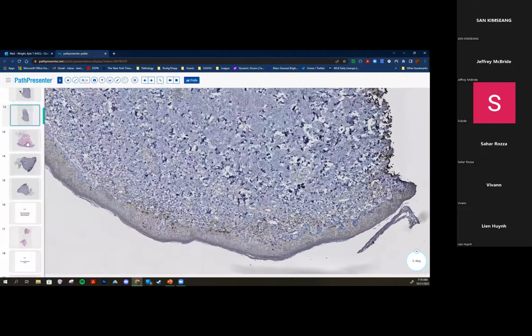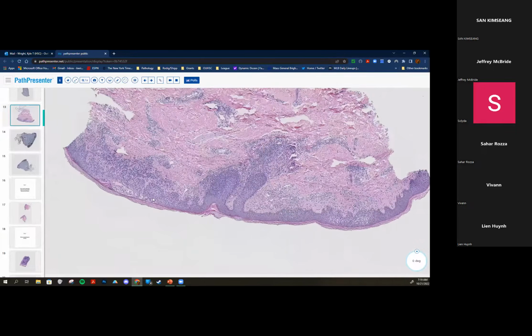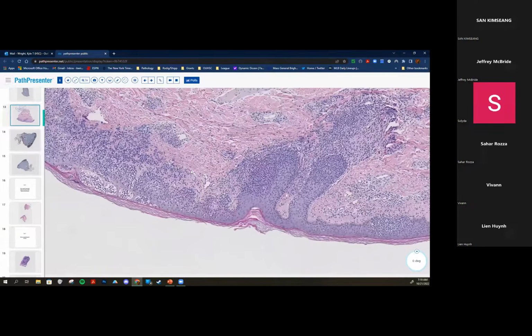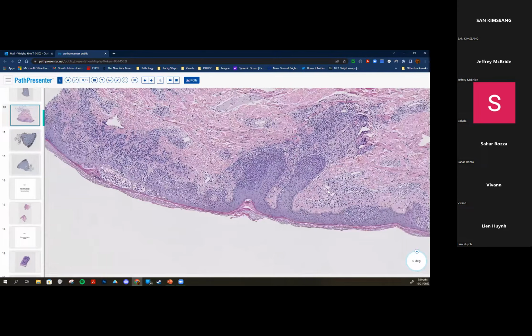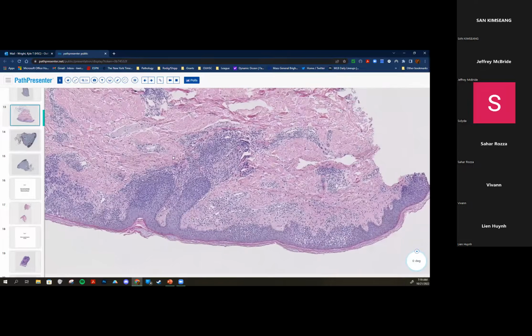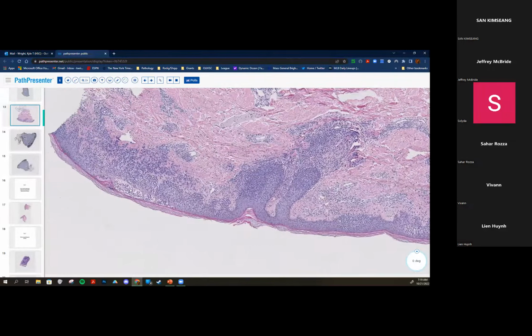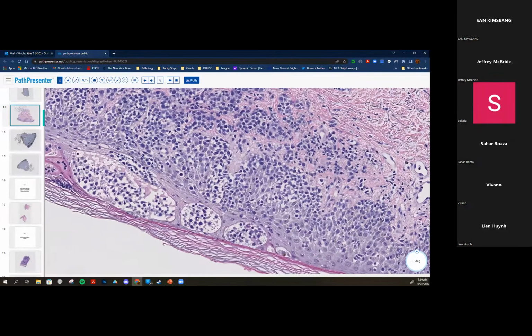Okay. From the other body site, you can see something that looks somewhat similar, but also has some different qualities here. The inflammatory infiltrate is still positioned appropriately. So a superficial perivascular and periadnexal infiltrate, similar pattern of morphology and similar pattern of ingress up into the epidermis, so-called epidermotropism. And you get formation of these very large structures in the epidermis composed of these neoplastic cells. These are so-called Pautrier microabscesses.